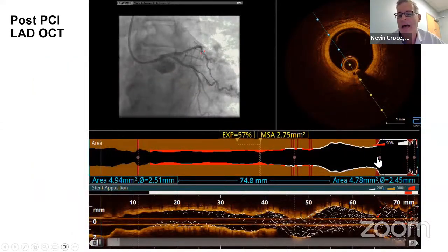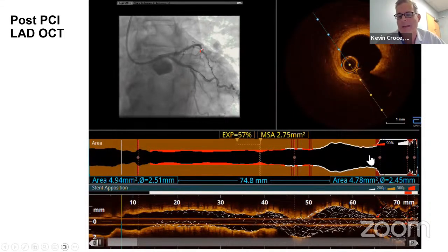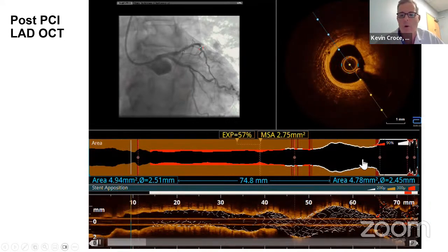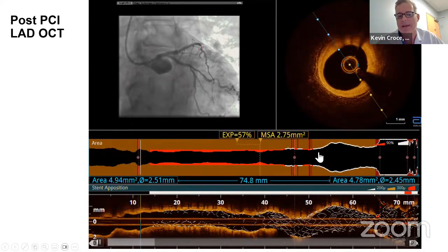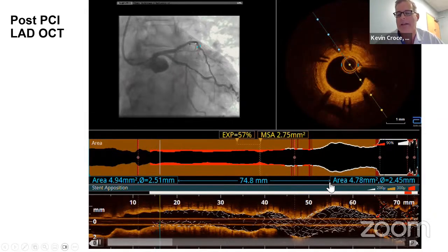And this is the hazard point of culotte and DK crush. Getting the pant leg openings to get big is the hard part. My new stent went to right here. All of this stuff that is imperfect is inherited. We decided not to treat.